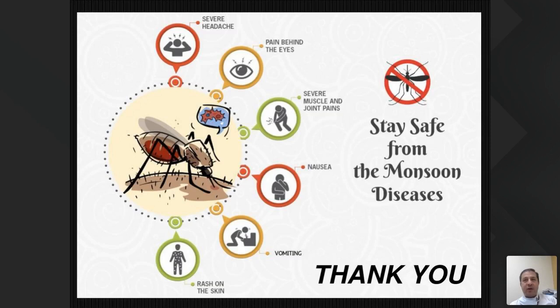For instance, if a dengue flag comes up on the HORIBA analyzer saying there is a possibility of dengue, I would start testing for dengue in this patient. Similarly, if a malaria flag is raised by the analyzer, I will surely want to see the thick smear of this patient and analyze whether I am really getting that or not. Because you have to understand that analyzers are not really identifying the parasite. They are identifying the non-lysed red blood cells. And many times you may not be 101% sure whether it's malaria or not. But most importantly, if the analyzer sensitizes you to go and review the smear, nothing like that. Life becomes much easier for any of us handling malaria, especially in the season that we are in.